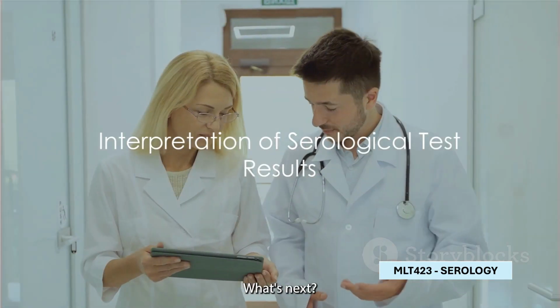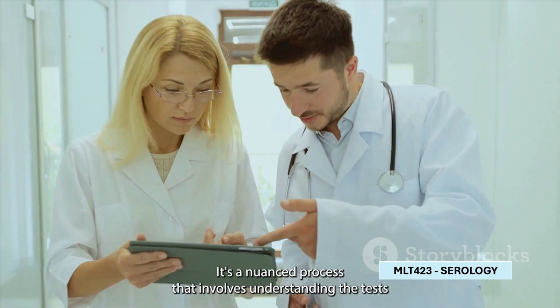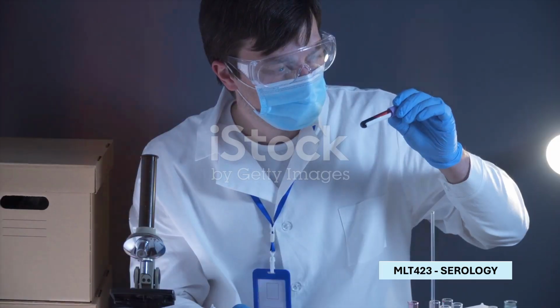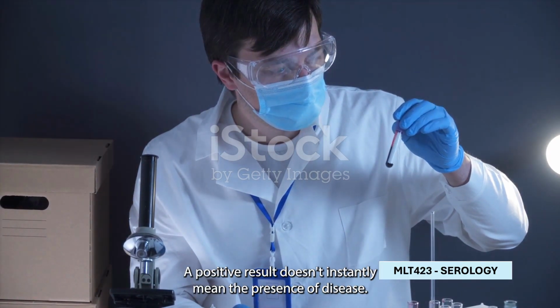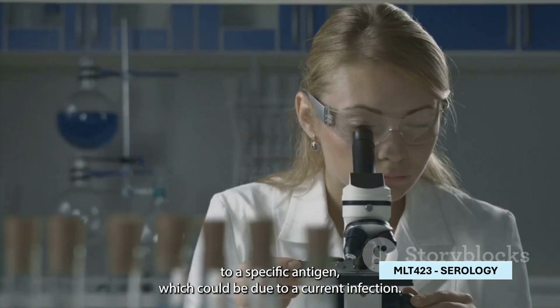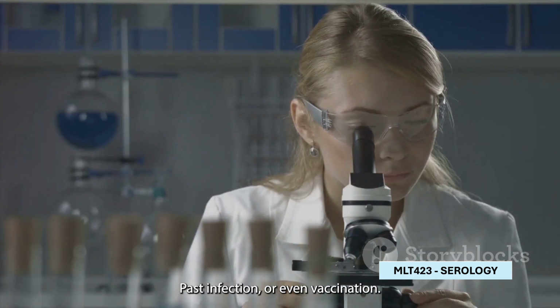Test results are in. What's next? Interpreting serological test results isn't as simple as a pass or fail exam. It's a nuanced process that involves understanding the test's purpose, the patient's history, and the clinical context. Consider positive and negative results. A positive result doesn't instantly mean the presence of disease. It indicates that the patient's immune system has reacted to a specific antigen, which could be due to a current infection, past infection, or even vaccination.